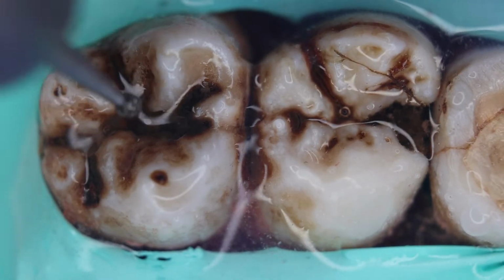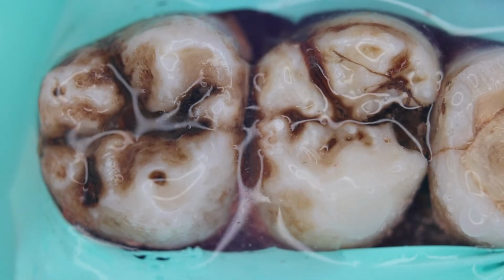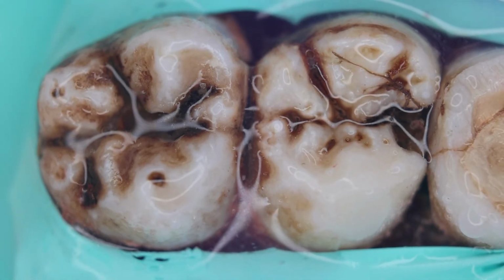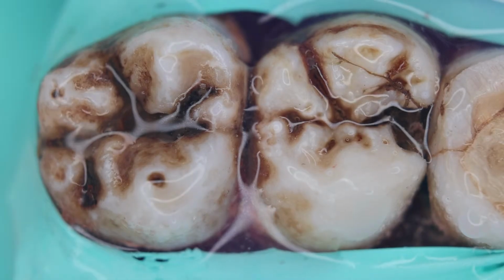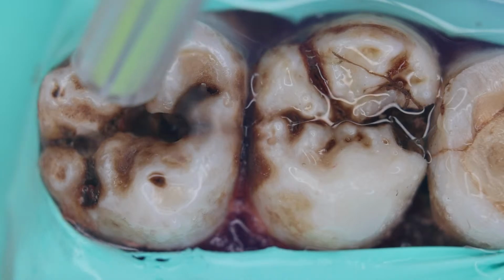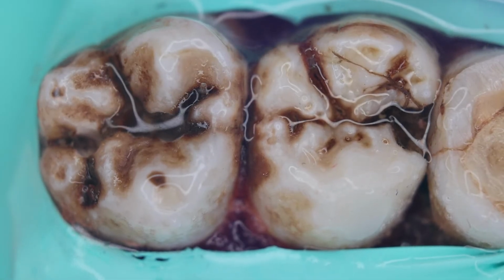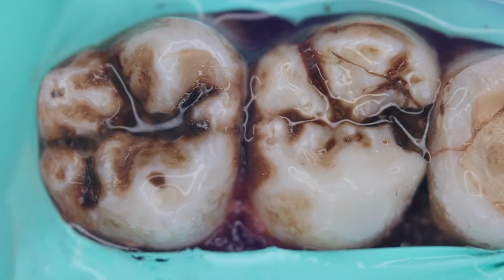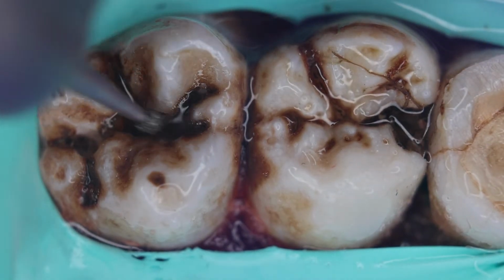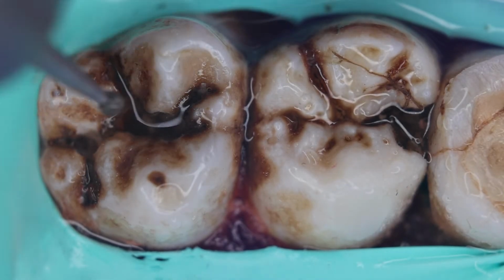So we have created these initial punch cuts at different parts. So now you can see or visualize it. And with the same burr, we are now getting into the pits and fissures of this molar.